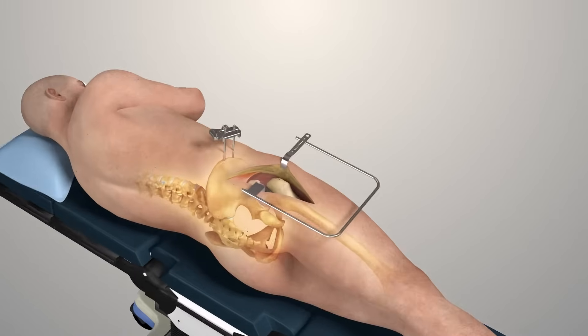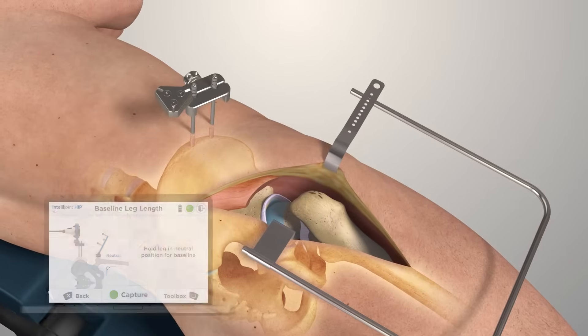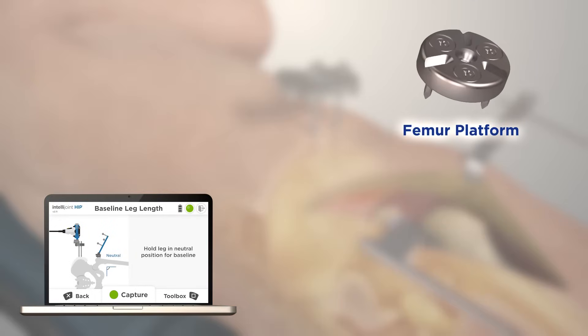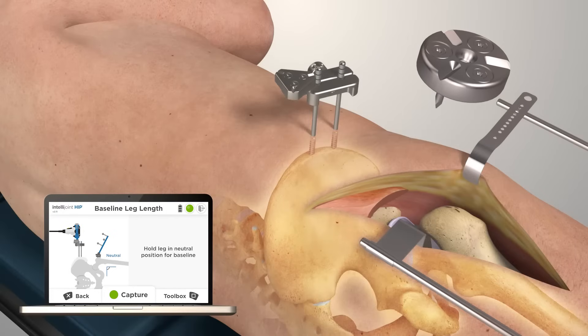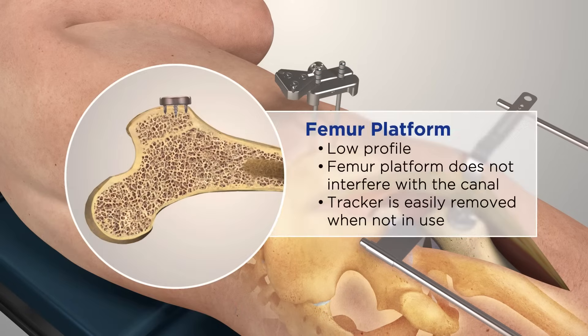Continue with the standard surgical workflow. The camera can be removed at this time to avoid any interference. The femur platform's low-profile design minimizes soft tissue interaction during the procedure. Using the inserter, tap the femur platform onto the greater trochanter, and insert the self-tapping femur screw. The femur platform spikes are designed to ensure there is no interference with the femoral canal.